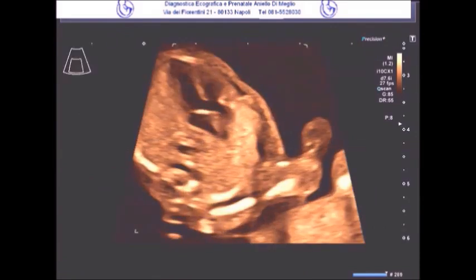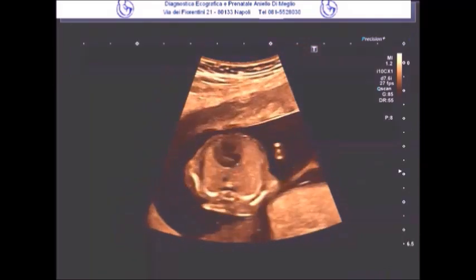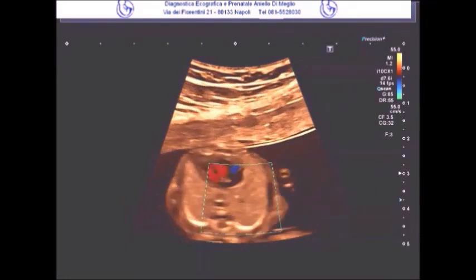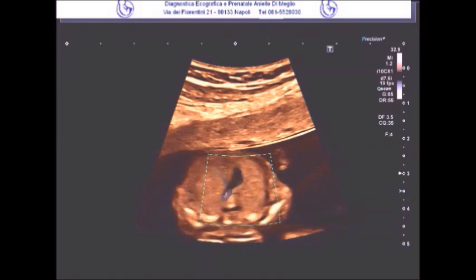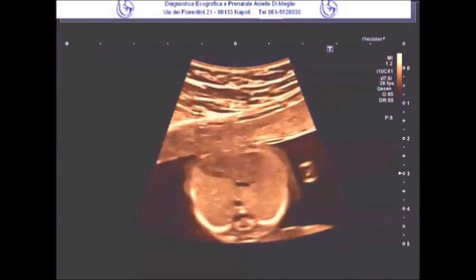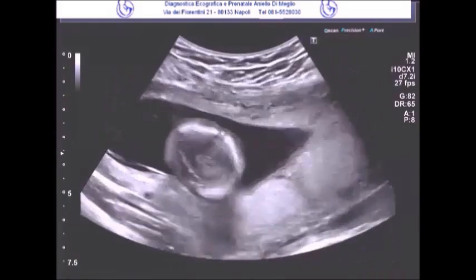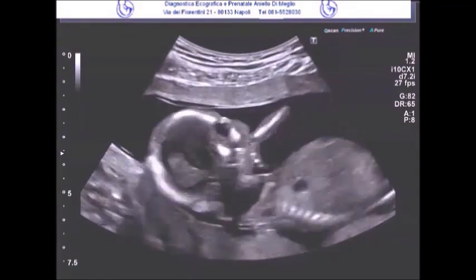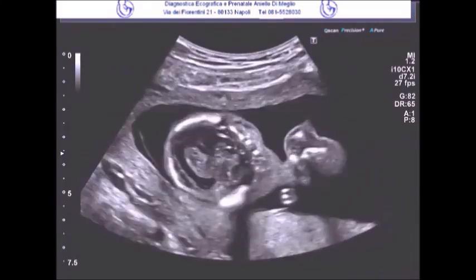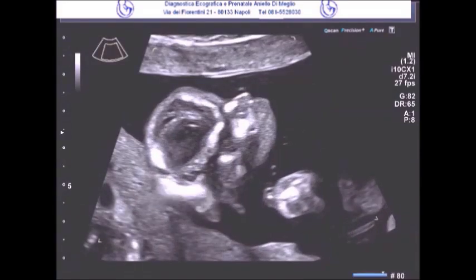The cardiac anatomy must be carefully studied and reviewed multiple times, and not only that. In fact, during the pre-structural phase, it is absolutely and fundamentally important for the clinician to reassess not only all the cardiac structures, but also all the other relevant anatomical structures. Among these in particular, we are now looking at the nuchal fold, which at this stage actually falls entirely within the expected normal range, just like the profile, which, as previously mentioned, is also completely normal. All the other described findings have also been thoroughly evaluated and are found to be normal.